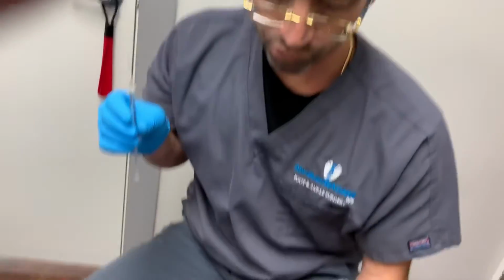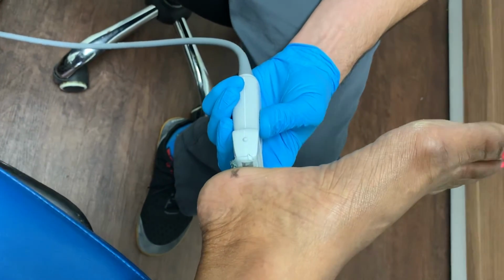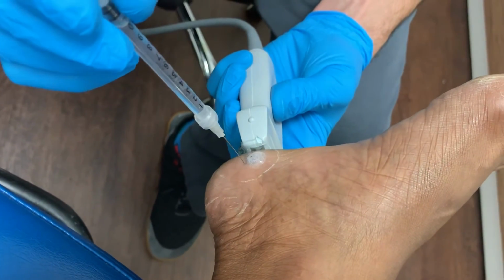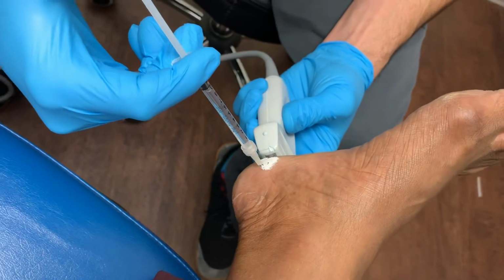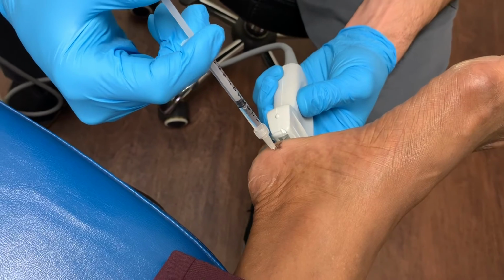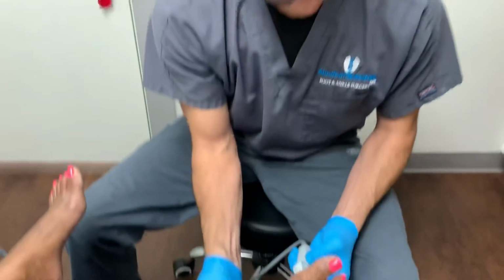And again, we use our ultrasound here. Everything looks, we're in the right location, and the patient is going to feel cold spray as we speak. Good. And sometimes we're using a very small needle, and here we go. And I don't like to just jam the needle into the heel because, believe it or not, the needle can break. It's a very, very small gauge needle, and just like that, we come out. Okay? So we're done with both injections.